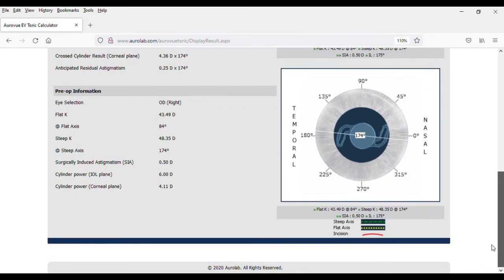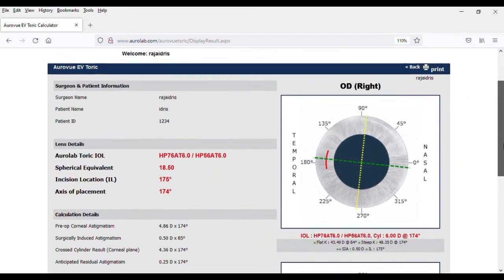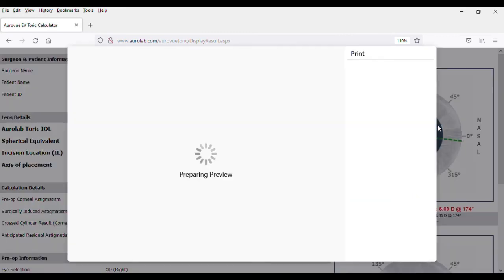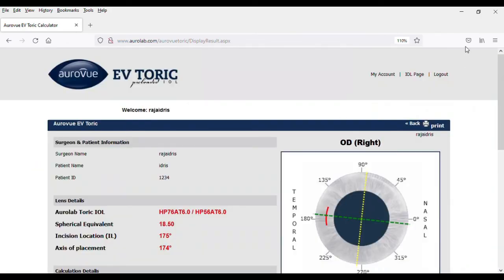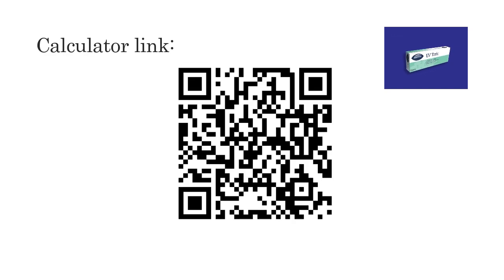Finally, users are able to print the patient information sheet that can be used as a reference. Here are the QR codes for the guidance video and the calculator for your reference.